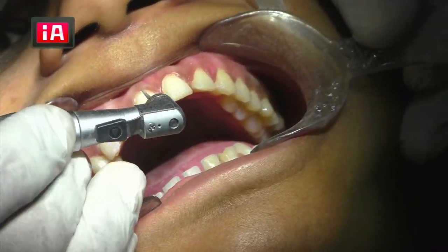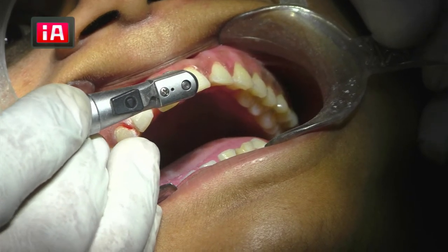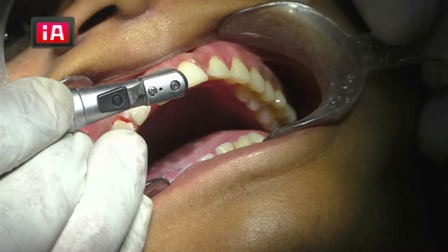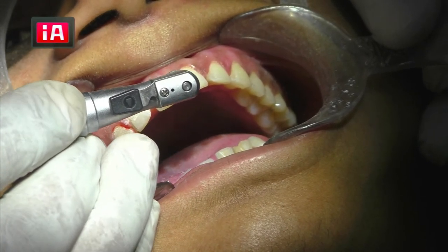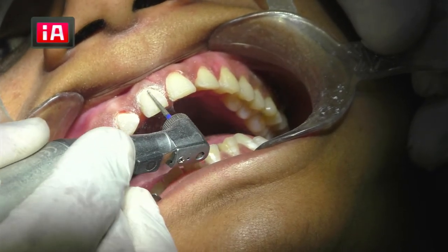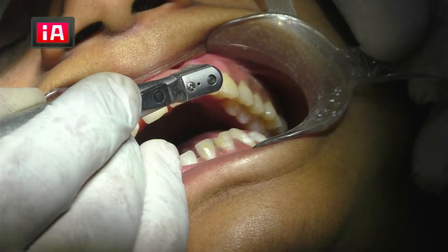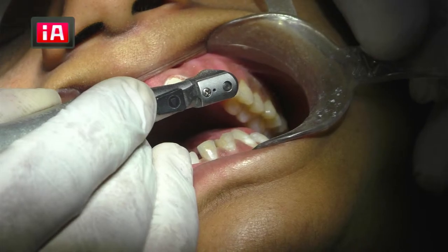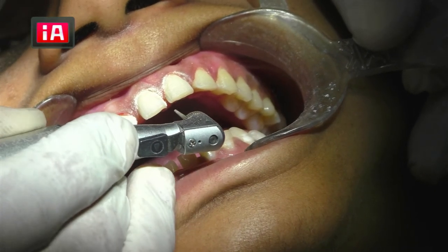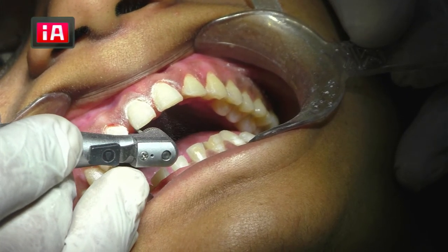I always prefer using a micromotor bur, even for indirect restorations, inlay, onlay, everywhere, before going for finishing, so that I can have better visualization. Because this is a very thin preparation, there should not be any excess cutting or under cutting. It has to be very, very precise. So I'm correcting the margin, making it very equal and uniform. Properly tapered as well.